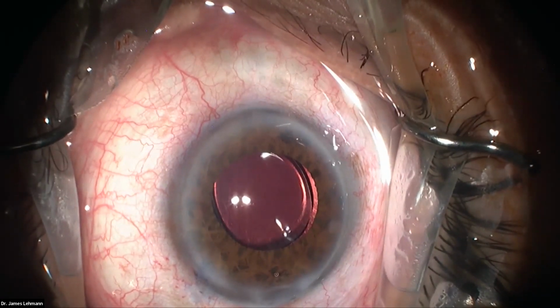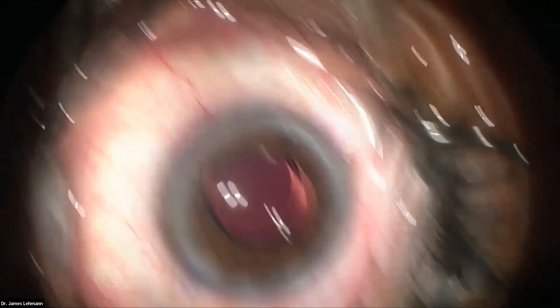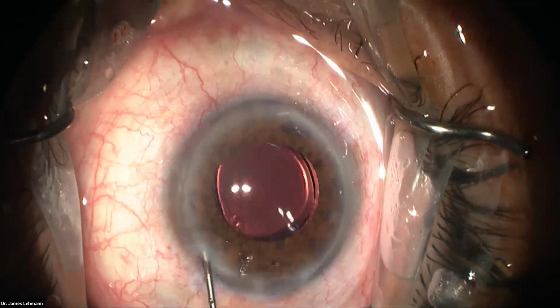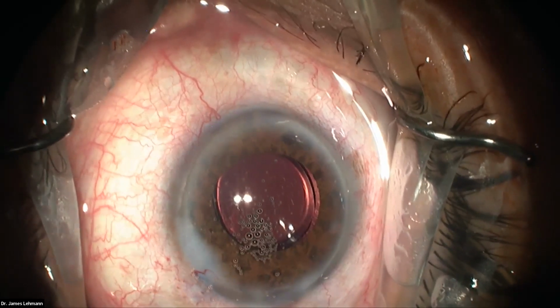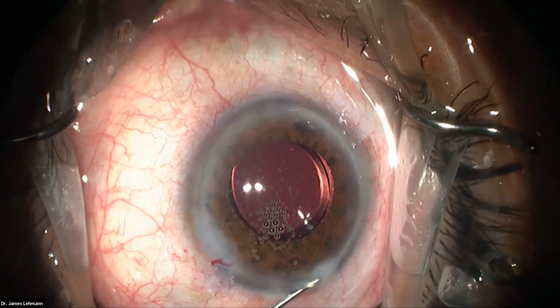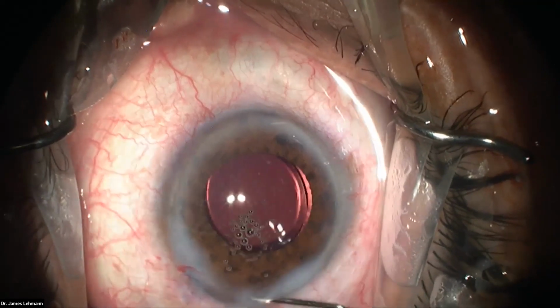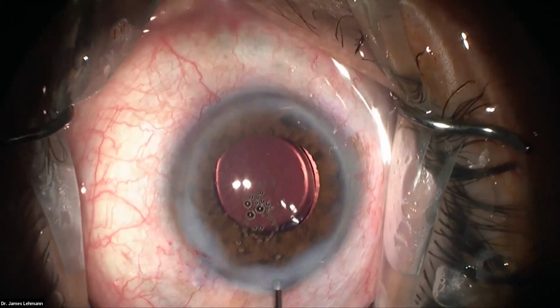And now we're going to do hydration of the wounds. So my first medicine, that's this one. This is dexamethasone with moxifloxacin, and then this is just BSS. So with the smaller TB syringe, I'm going to go in, inject some of that antibiotic and steroid, and then use the rest of it to do some stromal hydration of my paracentesis there. And then I'm going to close my wound with stromal hydration. First, I go on the right side of the lip. You want to see that whitening of the stroma. And then I go on the left side of the lip. You want to see that whitening. And then I go into the roof of the incision, and you want to see some whitening there.